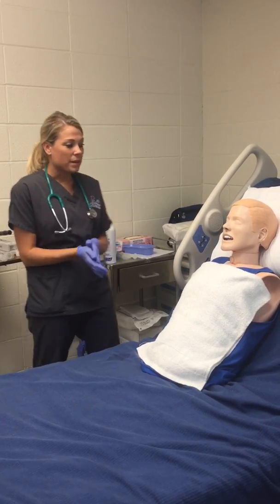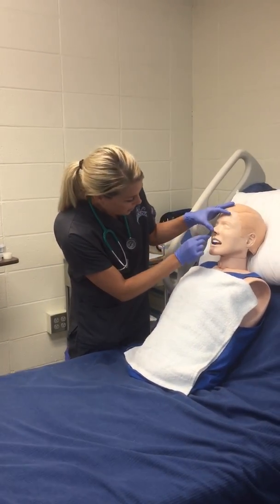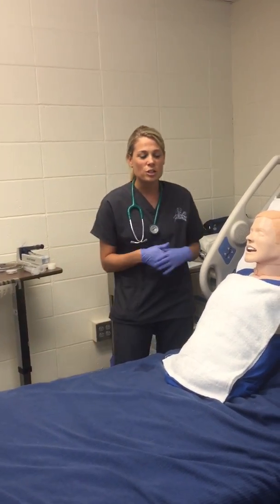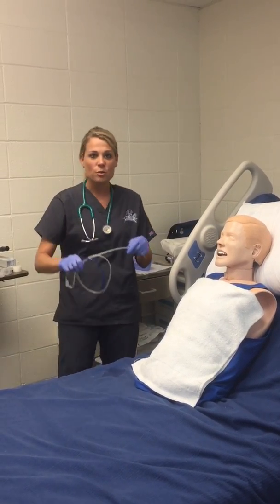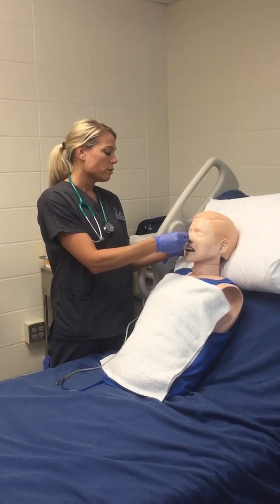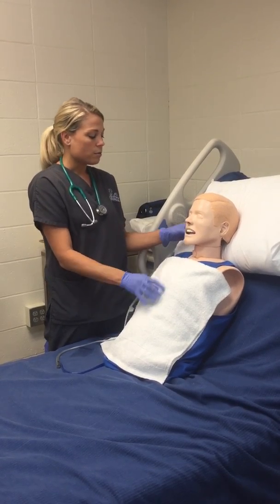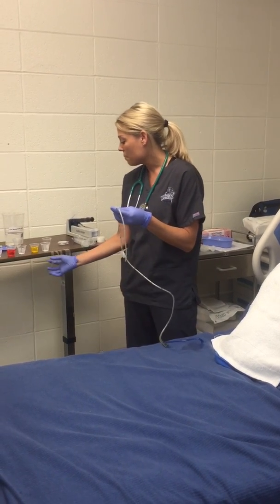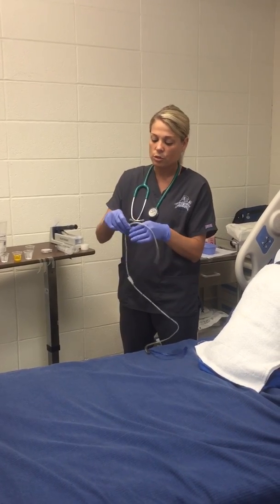I would also have a pen light, and I would use the pen light to check the nares and the patency and decide which naris would be the best one to use for the NG tube. And then after that, I would take the NG tube and measure from the tip of the nose to the earlobe, and then from the earlobe down to the xiphoid process. I would take that measurement and mark it with tape, so I know how far we're going to insert the NG tube.